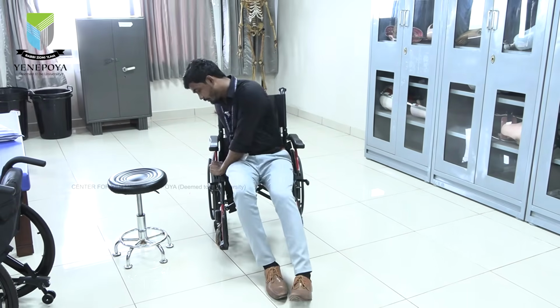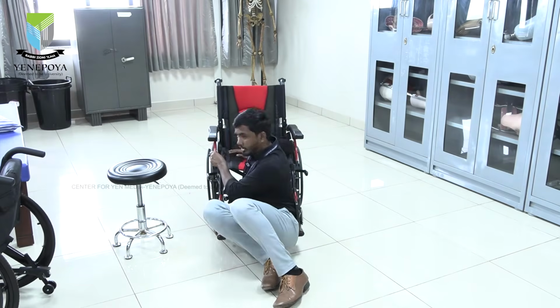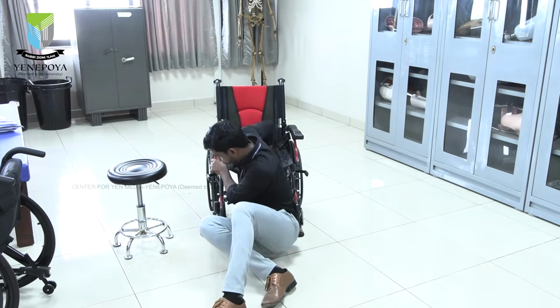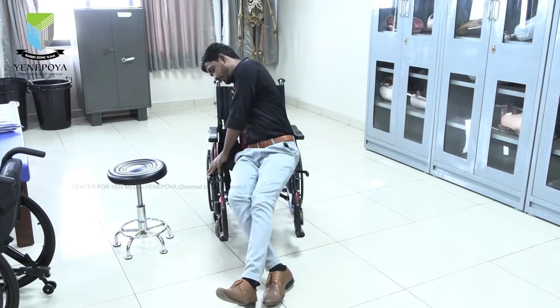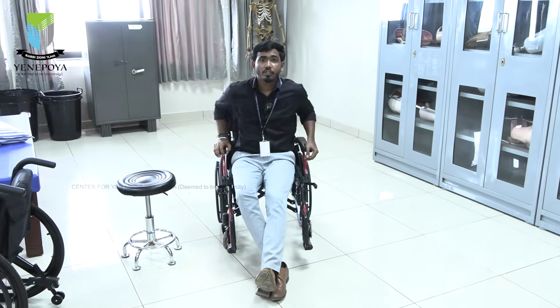So the person can do it sideways also. For that the left hand should go to the right side. So they will go like this and they will sit like this. Then afterward the same game. So you have to give pressure. Then they will drag their body like this and they will sit here. So these are the most common things the person will do in spinal cord injury.